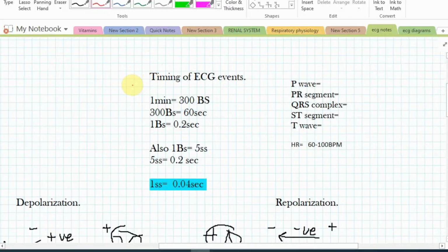We know that when you see an ECG paper, you have a big square. The ECG paper has darkened squares, and each big square has 5 small squares horizontally and vertically. There are different speeds of various ECG papers.